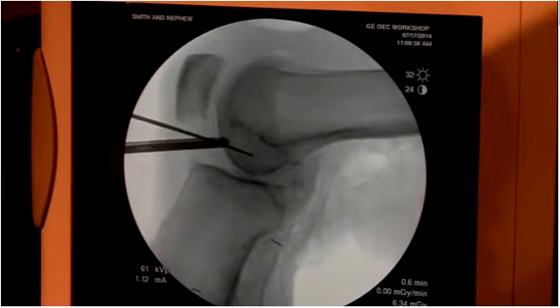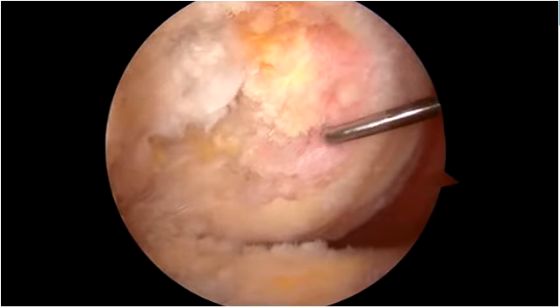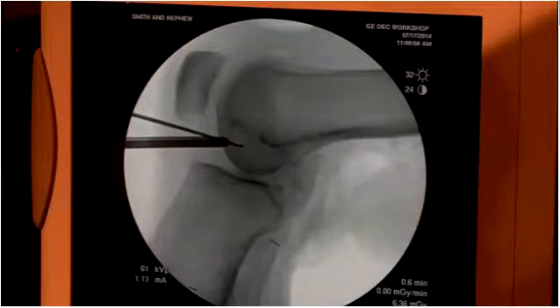And usually, a nice thing, as many patients have this meniscofemoral ligament, which you can nicely find if you put the knee in the figure of 4 position, that would normally be here. Then it's just in the middle of these two parts. So again, fluoro here. Yeah, so that's the middle of it. Do you agree with these positionings? We can see those well. Good, okay, thank you.